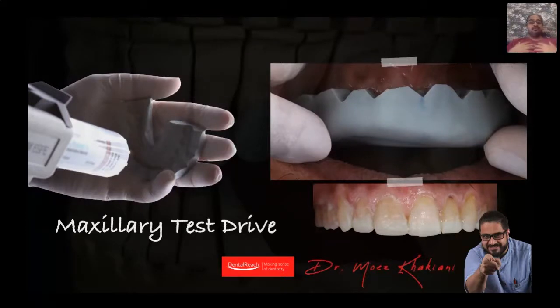What I love most about test drives is patient can see what I will be able to give the patient. More importantly, a test drive is a brilliant guide for me to do volumetric reduction. Remember, some teeth have more tooth that have been reduced because of attrition, some not as much. So when I'm doing volumetric reduction through a test drive, I only reduce tooth surfaces as much as is needed. Some teeth do not need any reduction because in a sense, nature has already done occlusal reduction for me. Over years, nature has created attrition and reduced that tooth off.